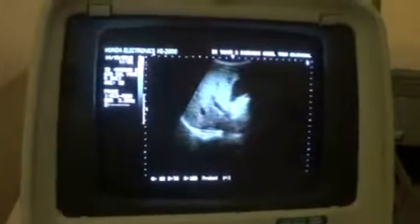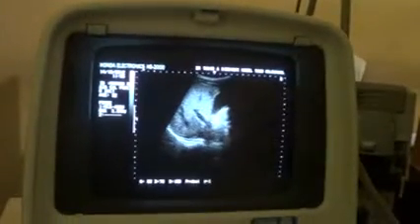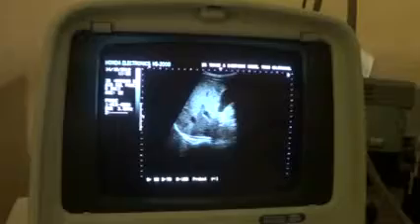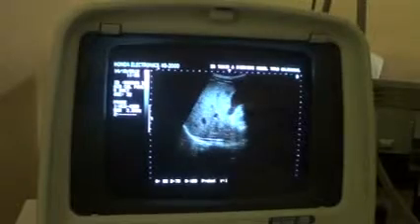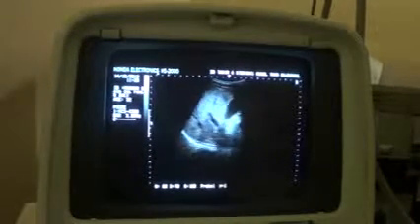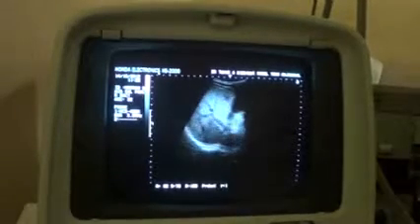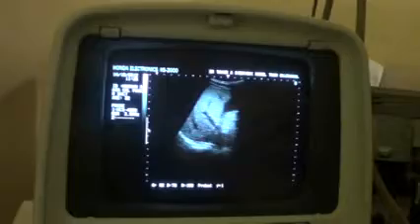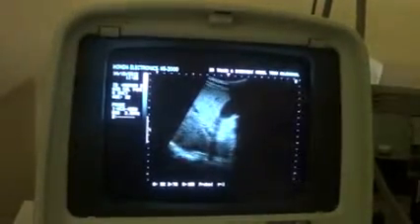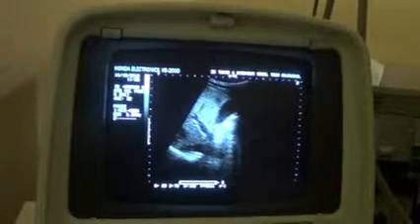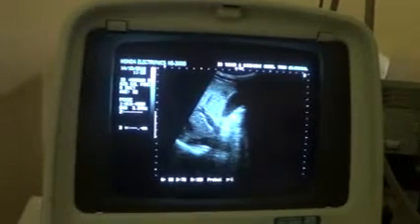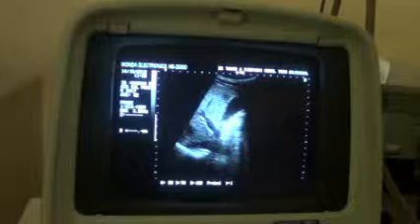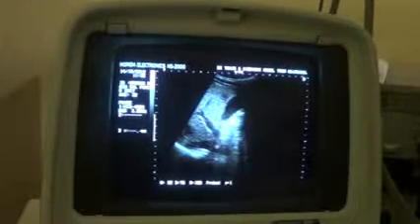Now this is the study of the same patient - yesterday we scanned regarding the calculus in the pancreatic duct which was dilated with fatty liver; the patient is Hassan Razai, 32 years. Today I asked him to come with an overnight fast. What we are seeing today is the gallbladder. Yesterday the gallbladder was not being dilated so easily as it is today. The gallbladder walls are normal and the lumen is clear. This is the portal vein, this is the inferior vena cava, and you can see the fatty liver parenchymal changes.